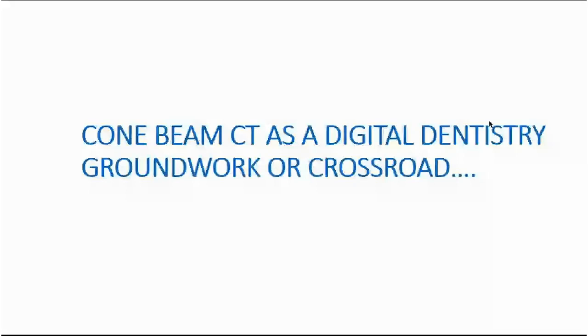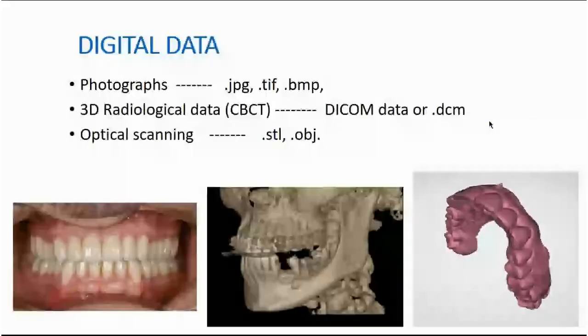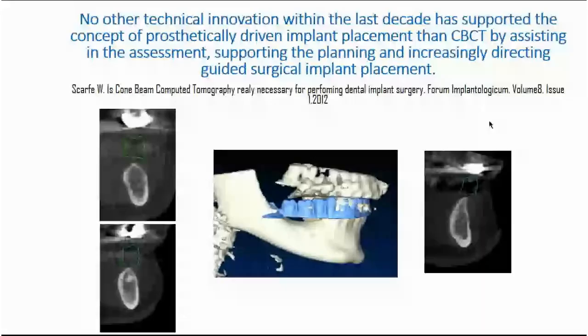And as a heart of all the digital procedures, we will have the CBCT. Also, we need to know that in our diagnostic procedures, we will need the photographs, we will need radiological data, we will need optical scannings, and we will need to inform us how to deal in between all these data together.